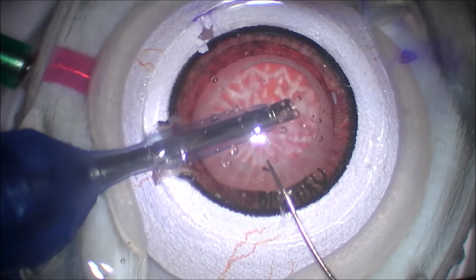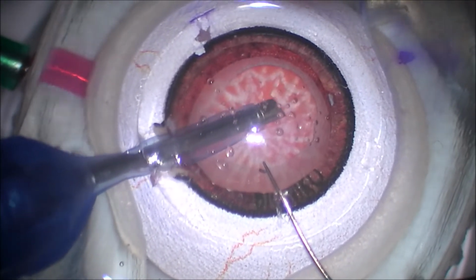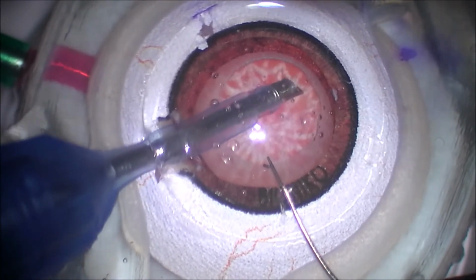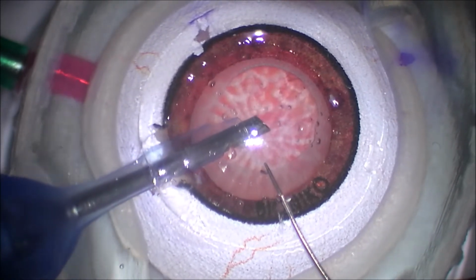And so a little bit cumbersome. Again, the folks at Bioniko told me that's why you need to have that head model. Of course, we didn't have access to that. And so we did the best we could, and it still was fine, but it was just a little bit cumbersome having to deal with the fluid.